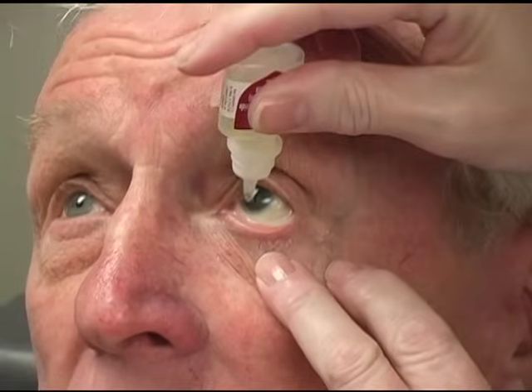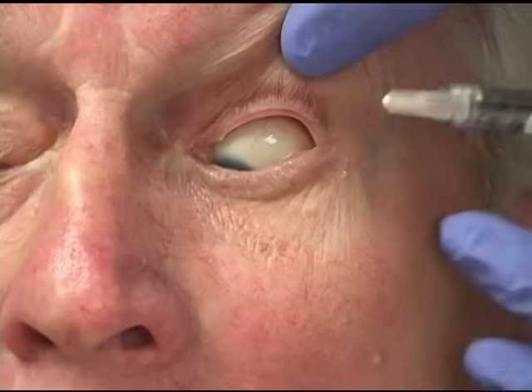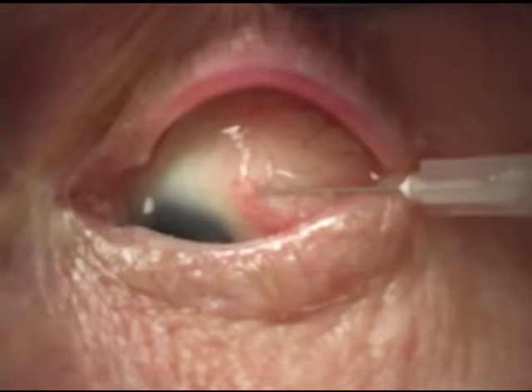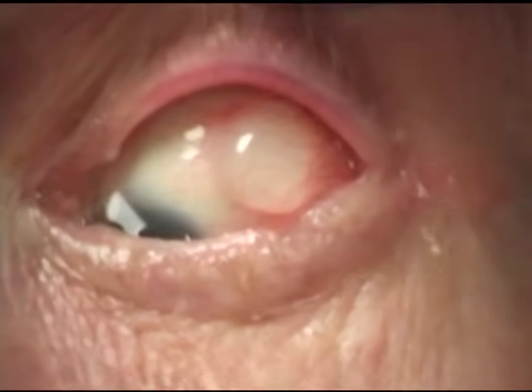We first place a topical anesthetic into the eye and this is followed by a topical antibiotic. Next we inject a small amount of xylocaine subconjunctivally, usually in the superior temporal quadrant. We raise a bleb of the anesthetic and allow this to remain in place for 3 minutes or more for anesthesia.